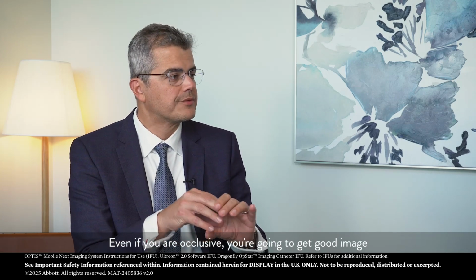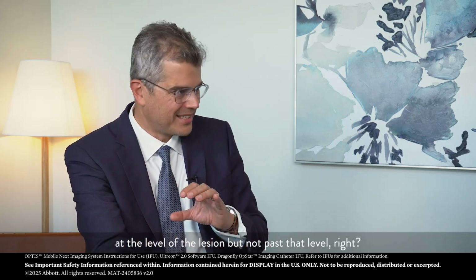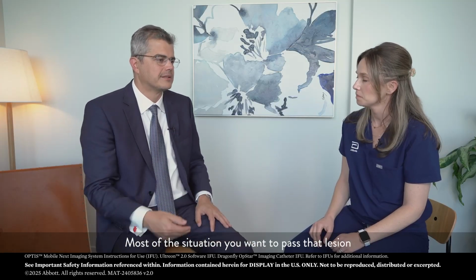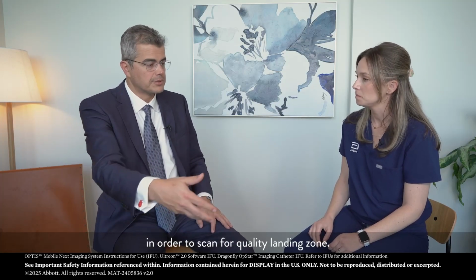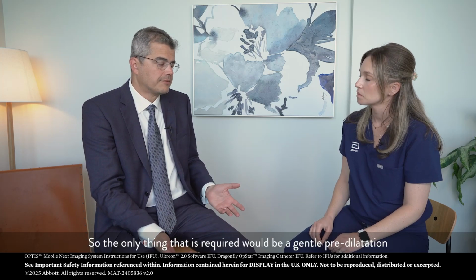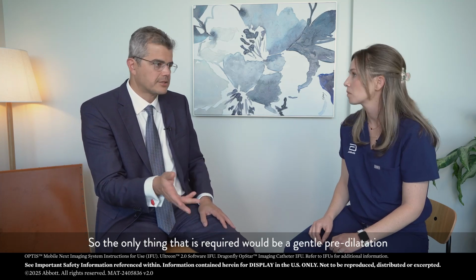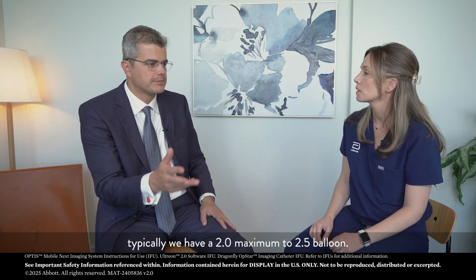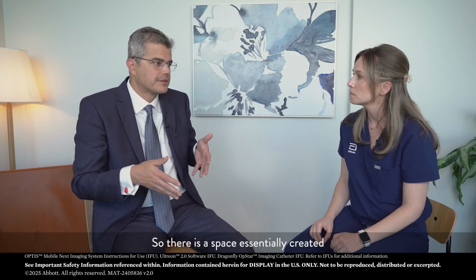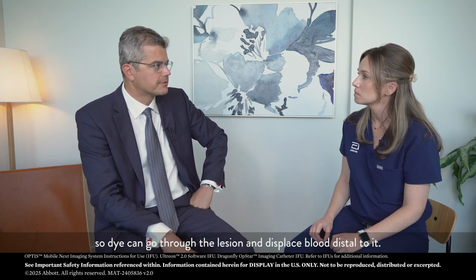Even if you're occlusive, you're going to get a good image at the level of the lesion, right, but not past that level. Most of the situations, you want to pass that lesion in order to scan for quality landing zone. So the only thing that is required would be a gentle pre-dilatation, typically with a 2.0, maximum 2.5 balloon. So there is space essentially created so dye can go through the lesion and displace blood distal to it.